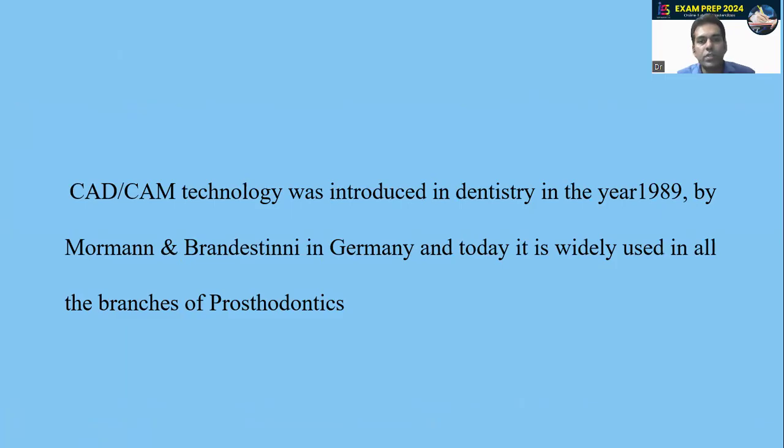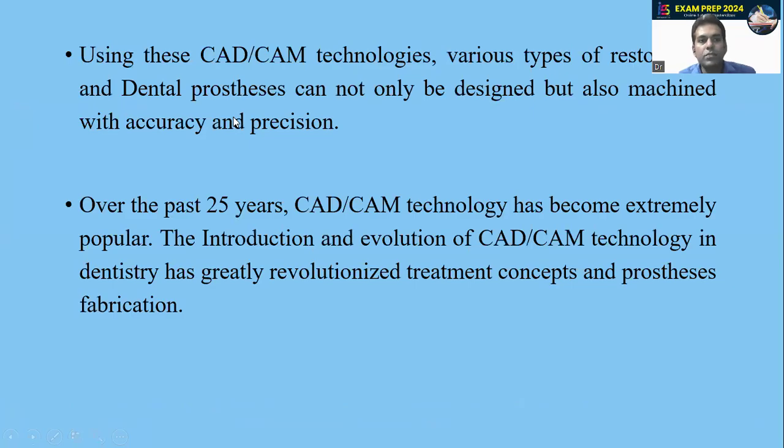CAD CAM technology was introduced in dentistry in the year 1989 by Moorman and Brandestini in Germany, and today it is widely used in all the branches of prosthodontics. Using these CAD CAM technologies, various types of restoration and dental prostheses can not only be designed but also machined with accuracy and precision. Over the past 25 years, CAD CAM technology has become extremely popular. The introduction and evolution of CAD CAM technology in dentistry has greatly revolutionized treatment concepts and prosthesis fabrication.